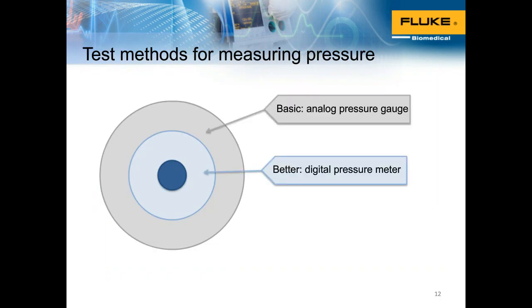The next thing is the electronic infusion device analyzer. If you're using that versus the pressure gauge, again, you are essentially starting the pump and it's going to tell you what the occlusion pressure is. So you don't really have to do anything there. You're essentially having the analyzer do all the work. So once you start the pump, it'll build a pressure and it'll actually alarm, and the analyzer will tell you whether the pressure reading on the analyzer is the same as the manufacturer's spec. So again, you're taking the variability and any errors related to that out of the equation.